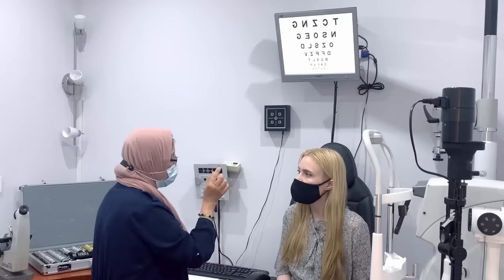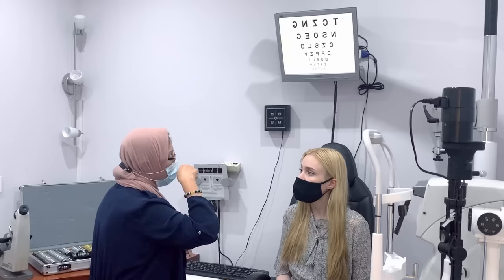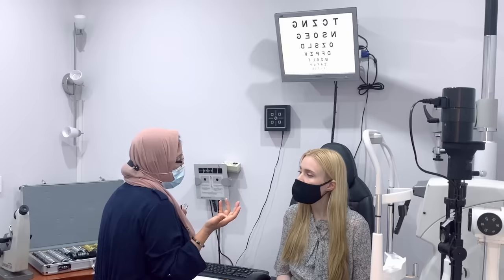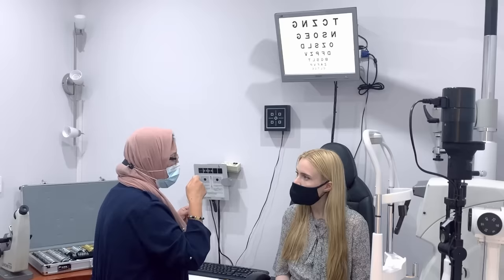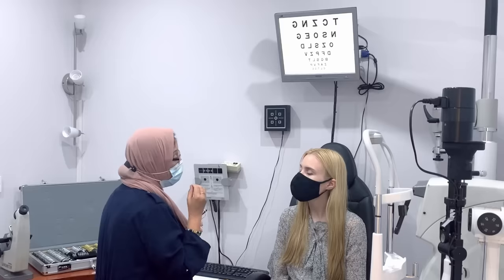Mine's hardly anything. Okay. But that quarter can come and go, in the sense some years you may appreciate the quarter, but other years you may not even appreciate it. So when they did these glasses, there was no astigmatism in them. But that's probably because you didn't notice the difference. But today you actually definitely said, oh, it's much clearer with that lens. So that showed you that you appreciated that quarter astigmatism.